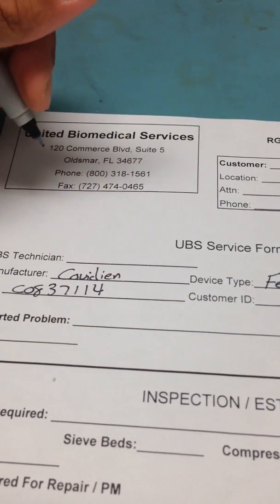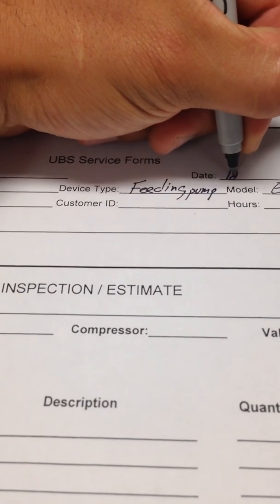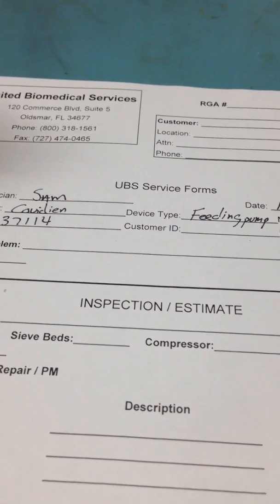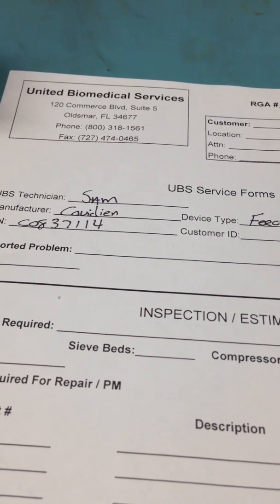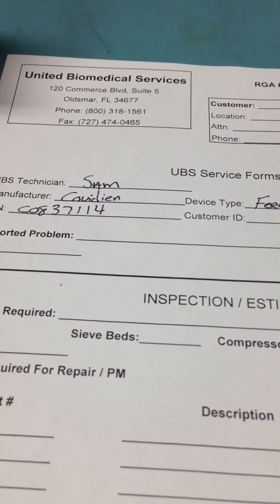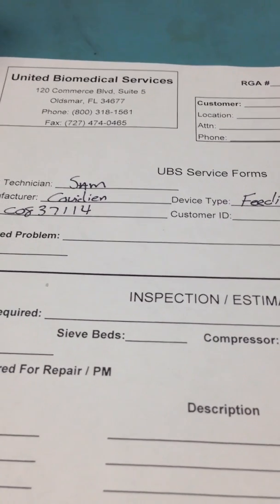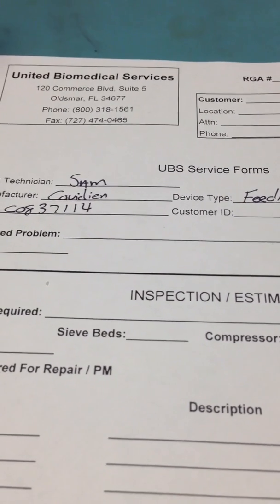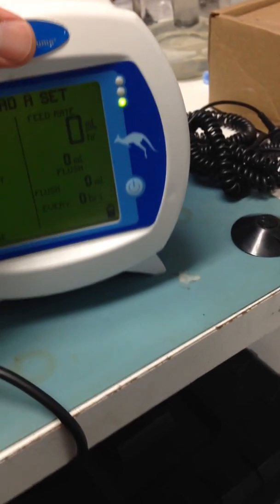Of course, you as the technician write your name and today's date. For the reported problem — if the medical device has any issues, a nurse or medical staff can let you know what's going on. Usually that's not the case, so you have to run a test called the accuracy test, and we're going to get it set up here.